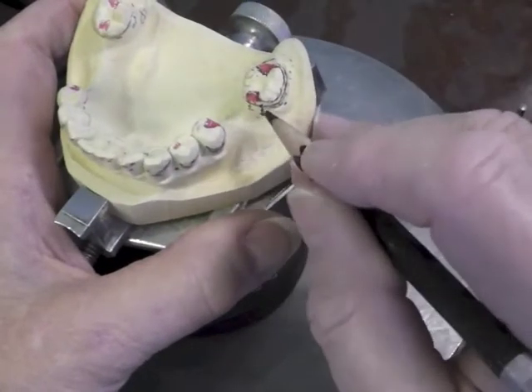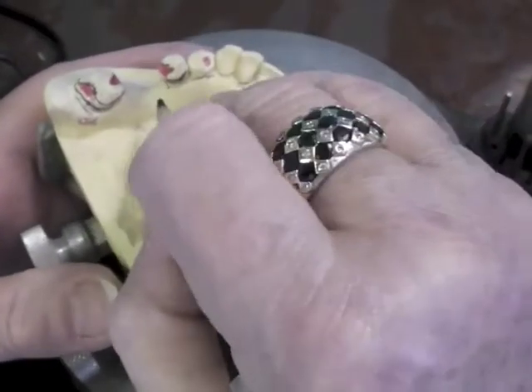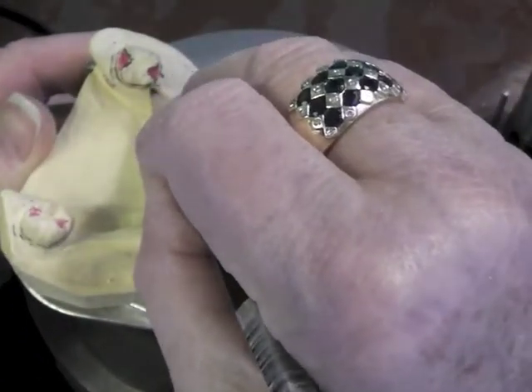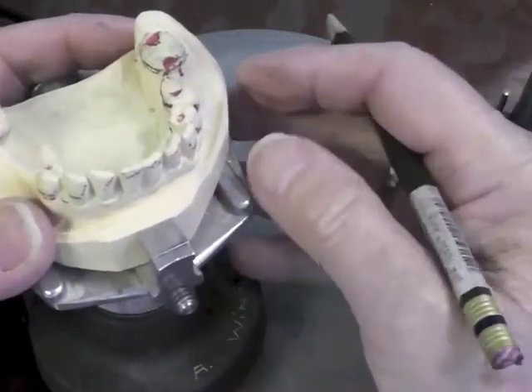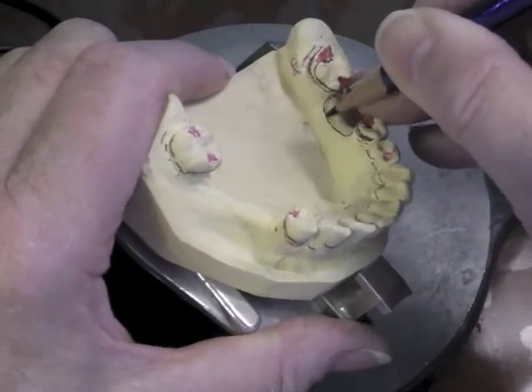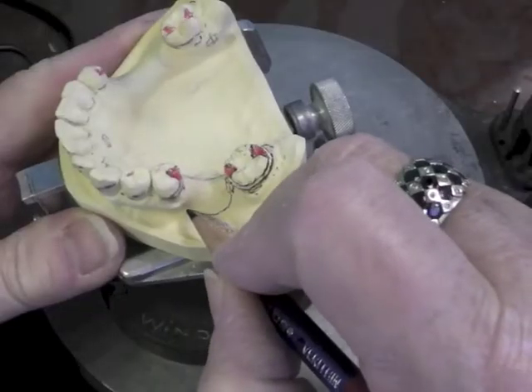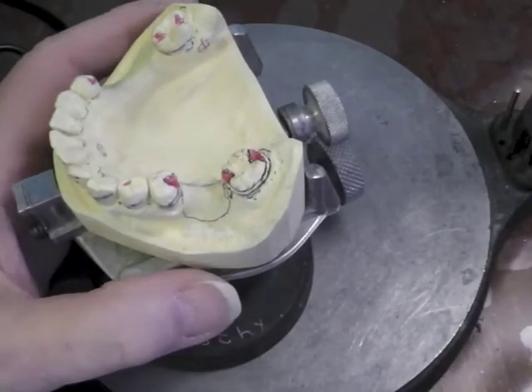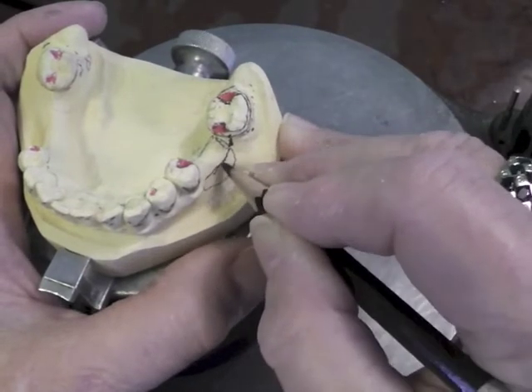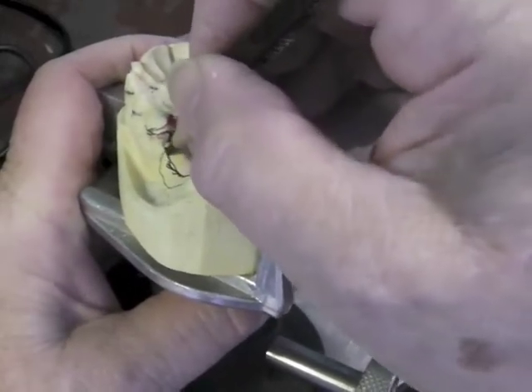We're going to have base attachment in this area, so the external finish line comes down at the distal lingual line angle of that premolar. It comes down keeping enough room to set a tooth in there, and it comes up and joins that guide plate right here on the mesial aspect of that molar. The base is going to come down here, come forward, go down into the depth of our vestibule, and come back up across our base attachment right there — that will give us some guidelines for our base attachment. So this guide plate comes down here, comes across, and goes back up to the guide plate on this side.